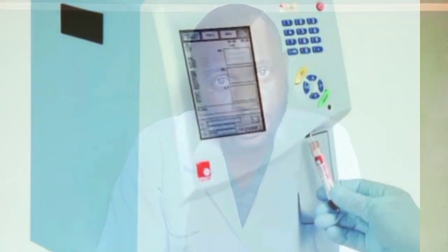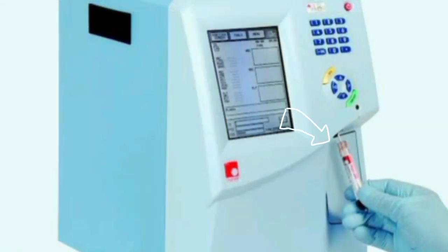While for the semi-automated, you have to manually take your sample to the probe and click on run, so the probe will aspirate the quantity of sample that it needs for analysis. So that's basically the two types of hematology auto analyzers.